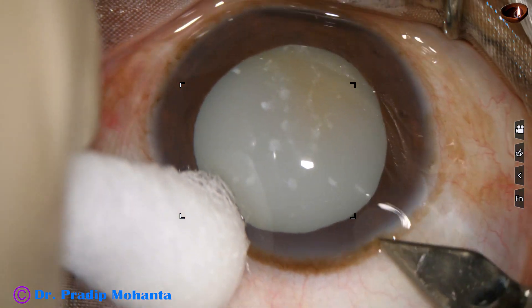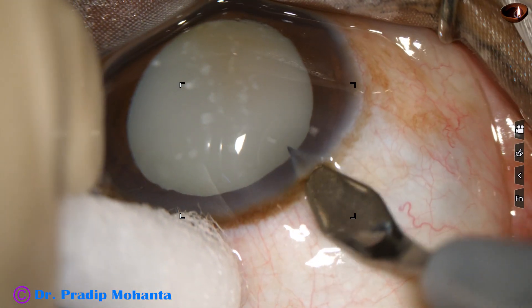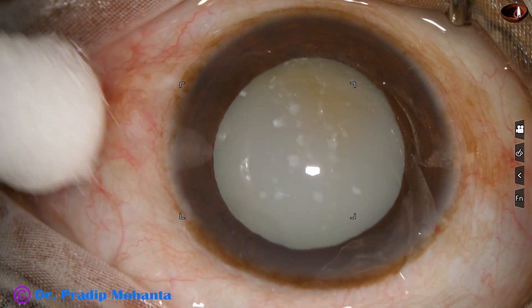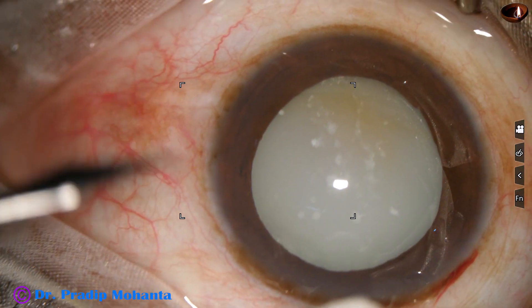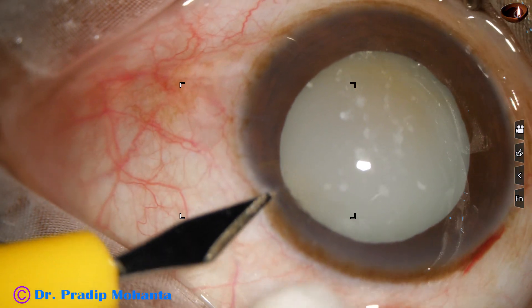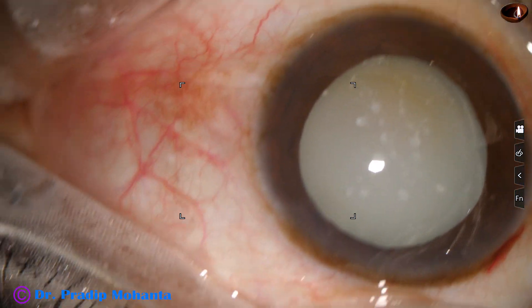This is the main incision at mid-limbus with a 2.8 millimeter steel keratome. And now a side port is made about 3 o'clock hours away from the main incision on the left side.